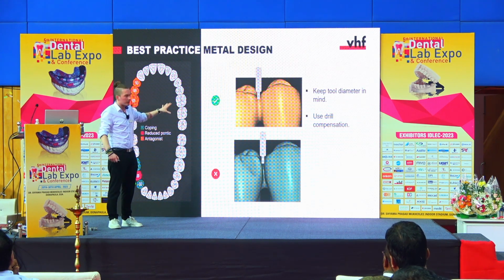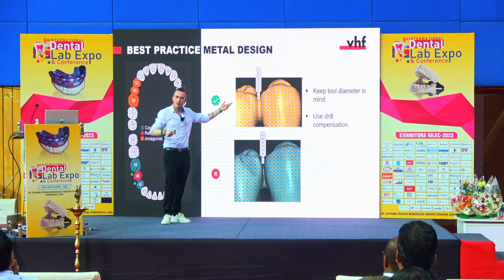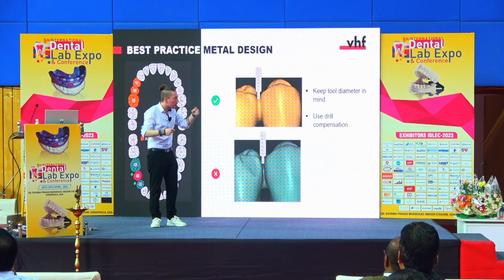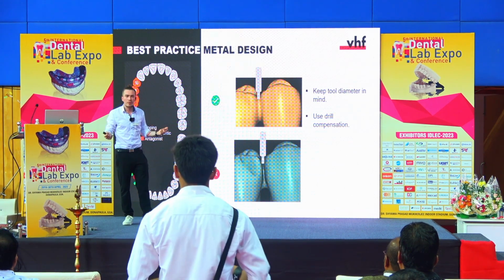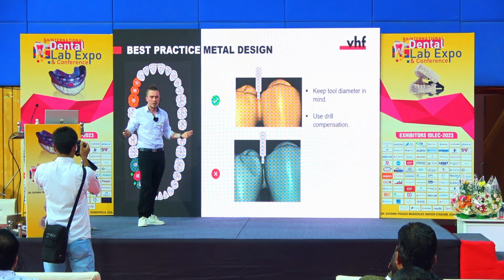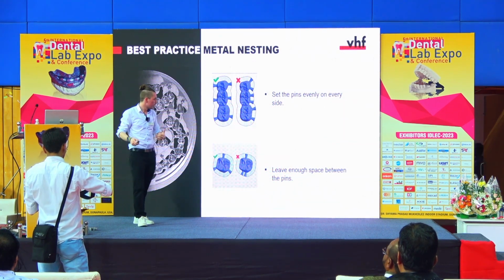You can compensate for this error just by keeping in mind how big your tool diameter is. Do I have drill compensation in my CAD software that already looks at the diameter of the tool for me? Use these tools to make a milling-friendly design, also without 90-degree angles, and then you have already compensated about 90% of the errors. The same goes also when it comes to the nesting.